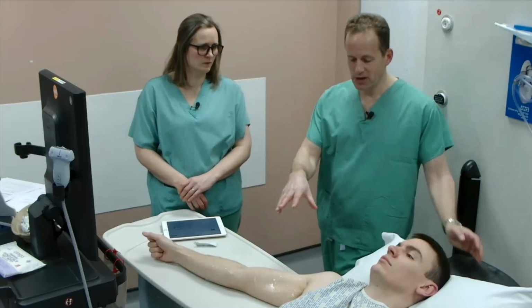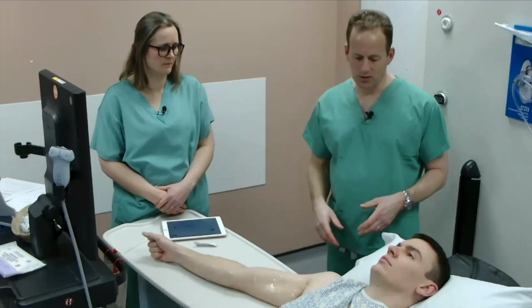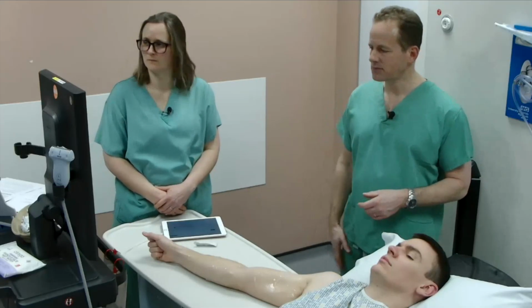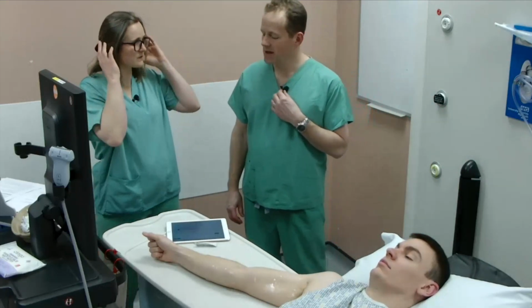So if I was in the middle of a block and there was something happening in there, I can leave that and come back to it. It's not the end of the world. This patient is awake. This patient's not sedated or anything. So I think there's one other thing that we have done, which is we've used AV.